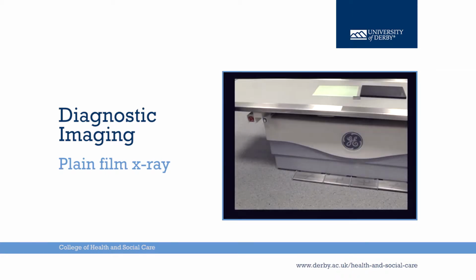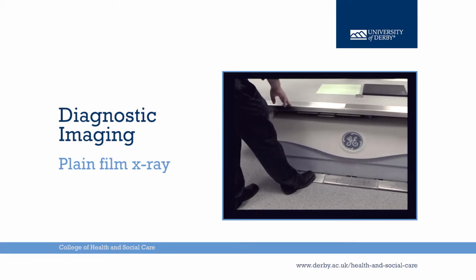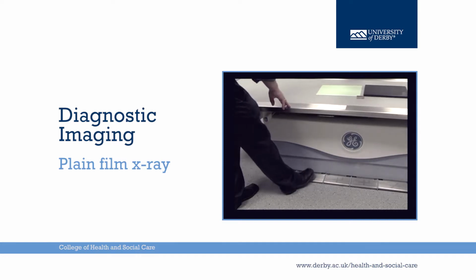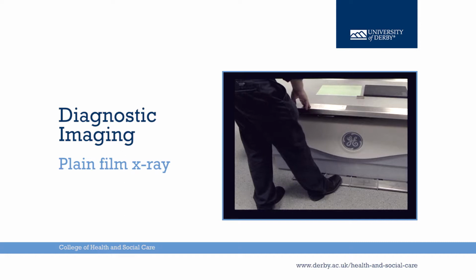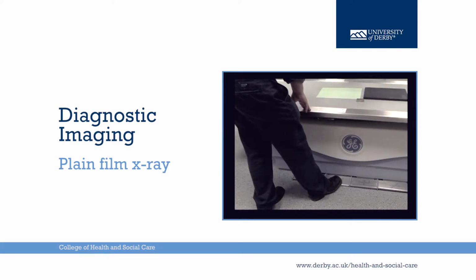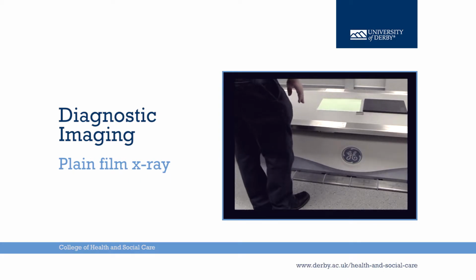This is a rise and fall floating top table. The first pedal, when you press twice, allows the top to be moved in all directions for positioning the patient. Second pedal, again depressed twice, allows the table to be lowered for easy access for the patient to get on and off the table.